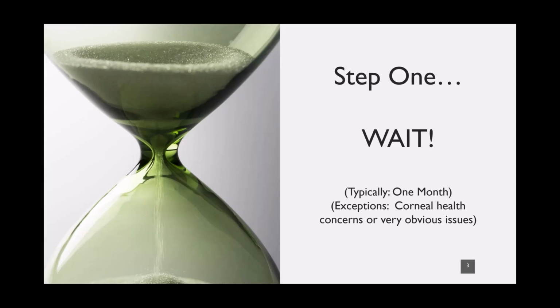If we're only doing the first follow-up after their first night of wear, or if we're only a week in, and the lens looks like it maybe doesn't have as much treatment as expected, or it looks like it's trying to decenter a little bit, it's always good to remember before you do any troubleshooting whatsoever to make sure that you've given that lens proper time to have its full treatment effect before you make any changes.